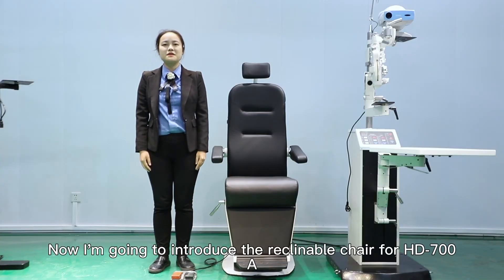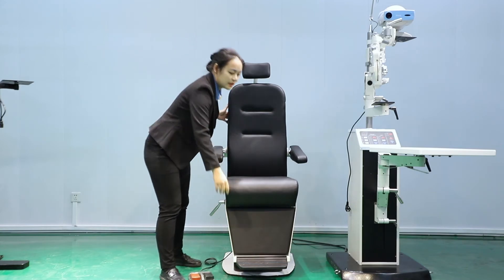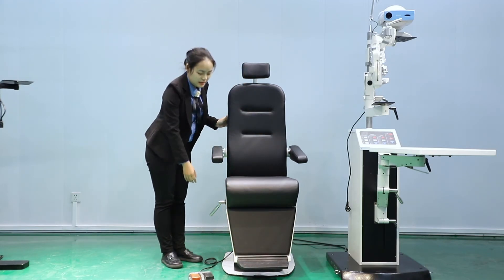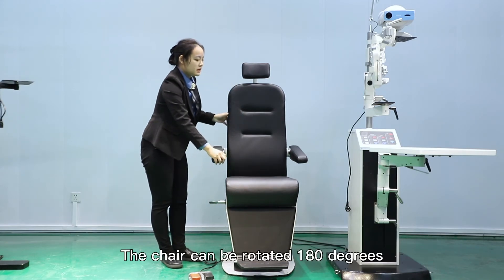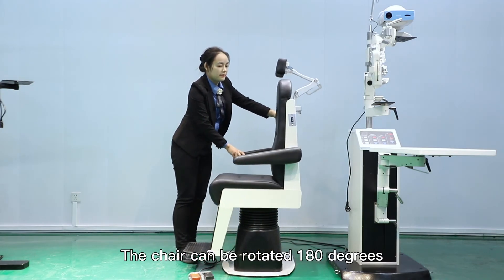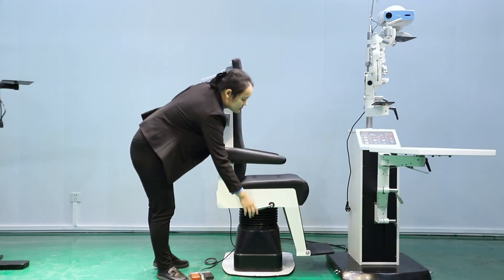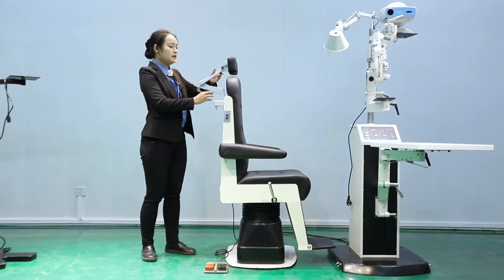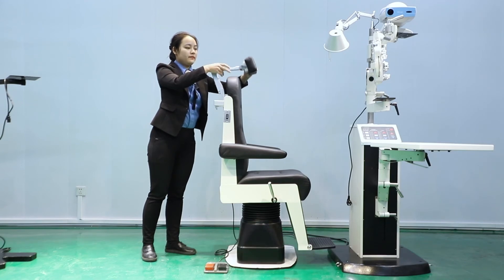Now I'm going to introduce the reclinable chair for HD 700A. As you can see, the armrest is foldable. The footrest is also foldable. Here is a lever for the chair — after loosening the lever, the chair can be rotated 180 degrees. The chair can be adjusted to a high position and a low position — very flexible.